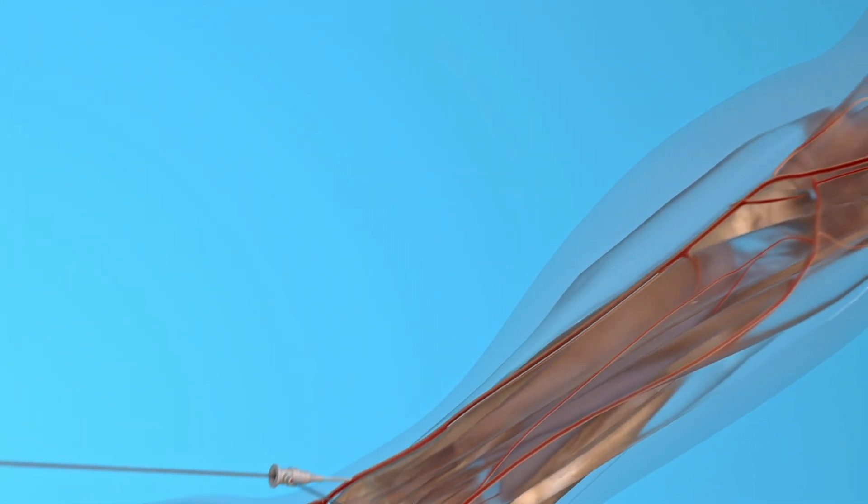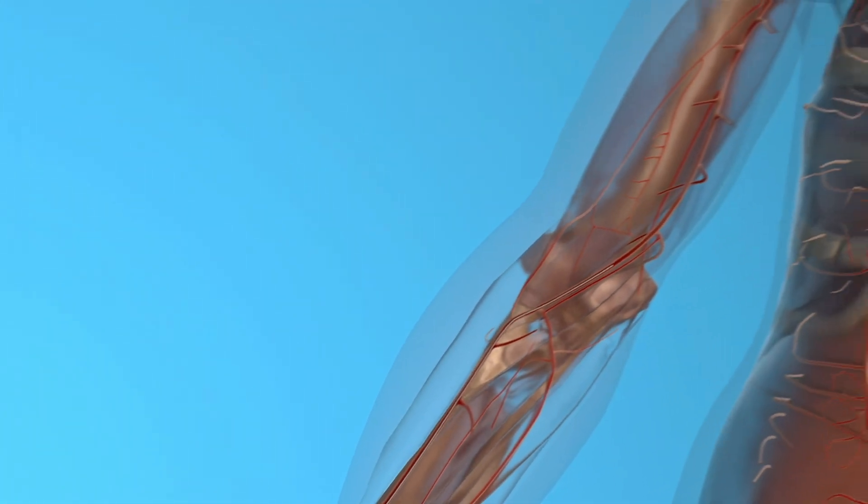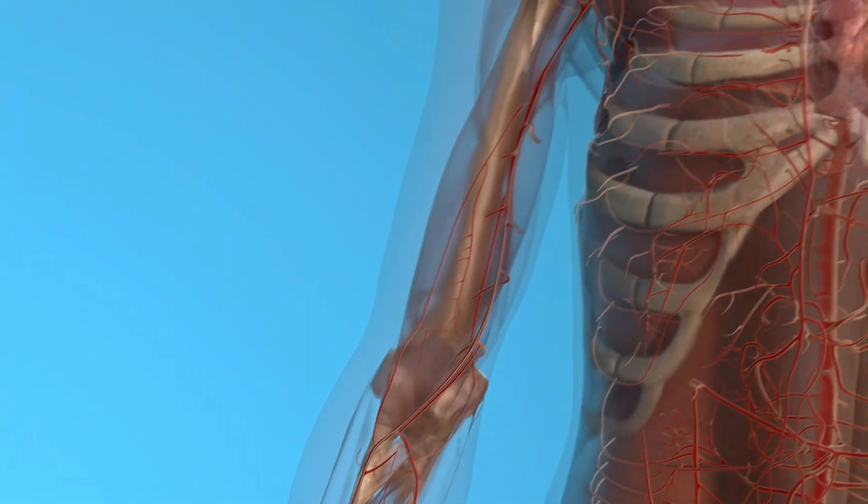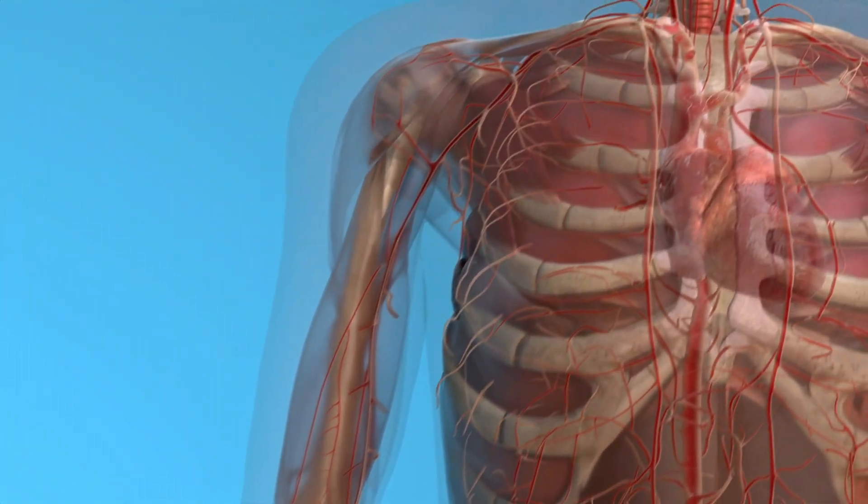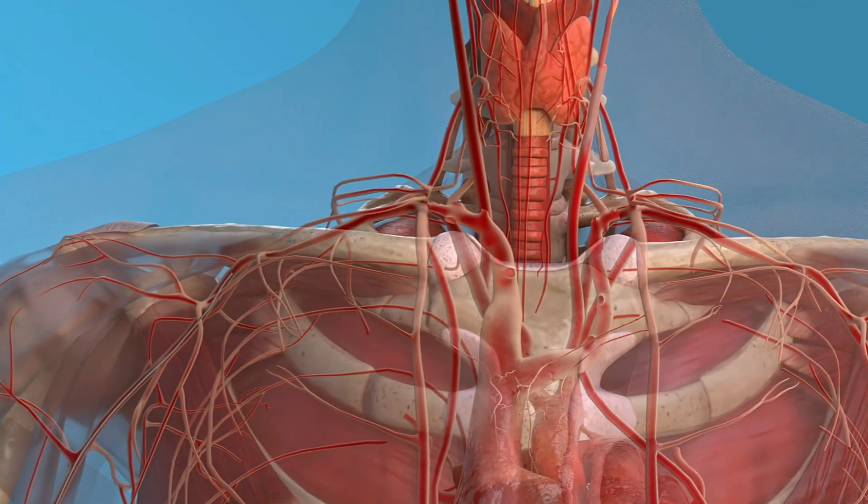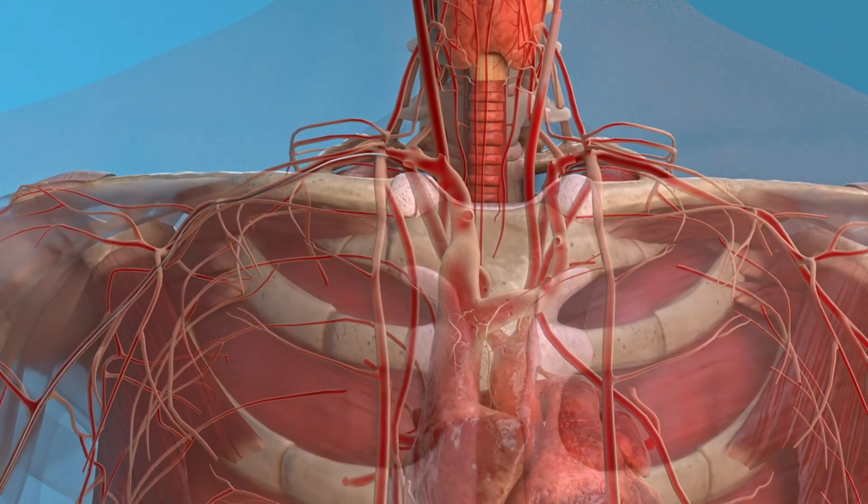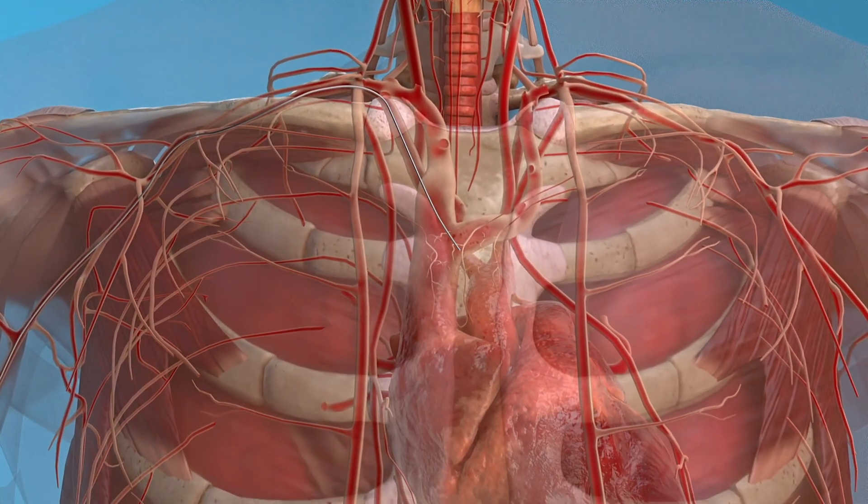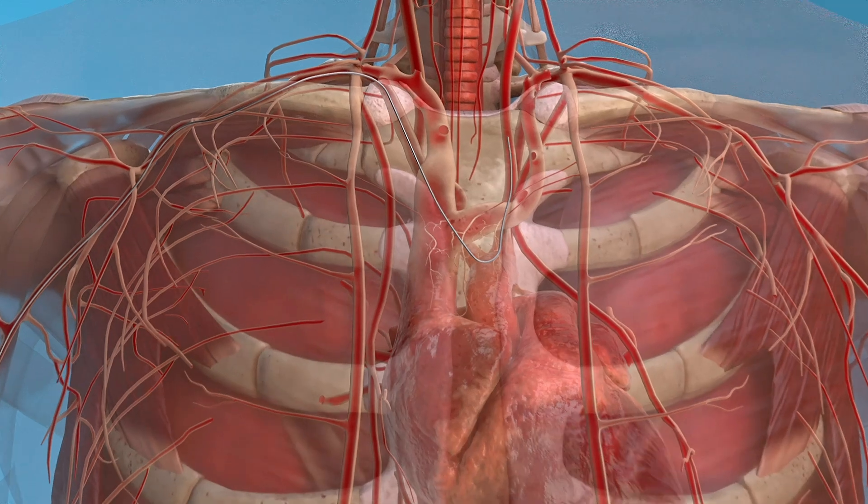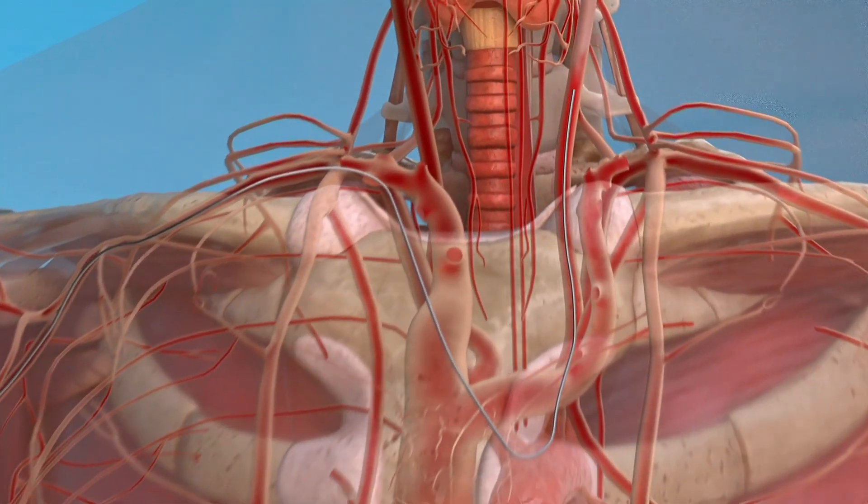Access through the radial artery is considered more difficult from a technical point of view. This is due to the small diameter of the artery, the tendency to spasm of the radial artery, and complex bends of the vascular bed along the course of the catheter. That being said, it's generally safer compared to femoral access.